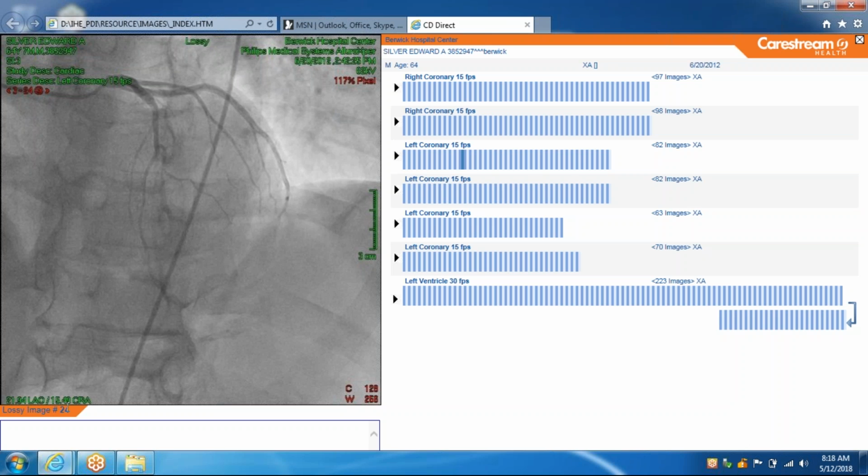The important thing to note is that with these coordinates, the left main coronary artery is right here, and then it splits into a LAD, left anterior descending coronary artery. The LAD is going to be the vessel that runs straight down. This is the spine. You can see the spine in the picture.